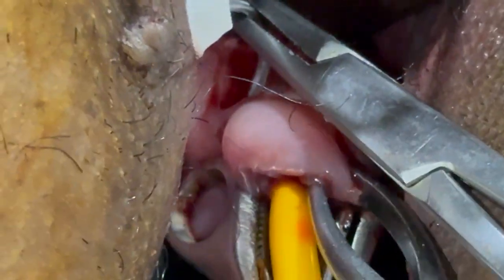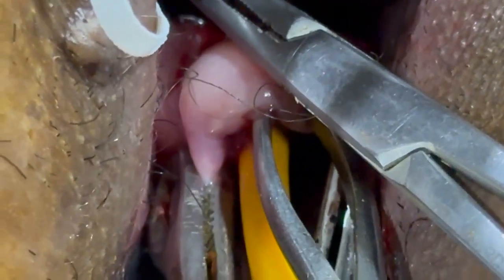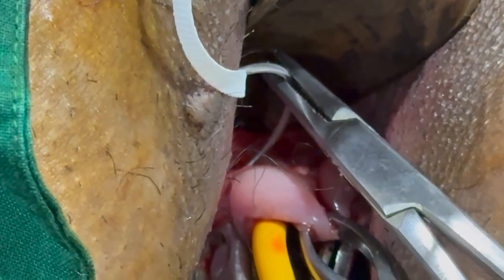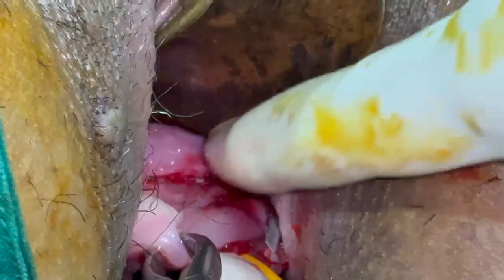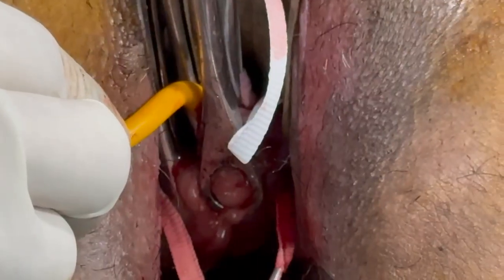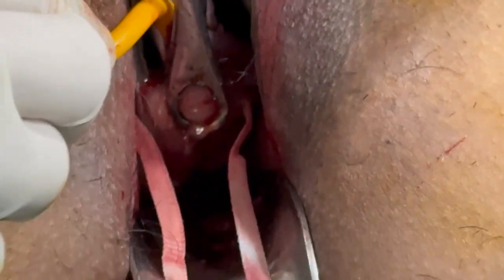As the space is very narrow, it is difficult to put the cervical stitch. We have to put it in the lateral wall of the cervix, but we should not go into the serosal space or the mucosal space. So this stitch was a little challenging. Further we tried a little dissection, and then the right side stitch was taken.